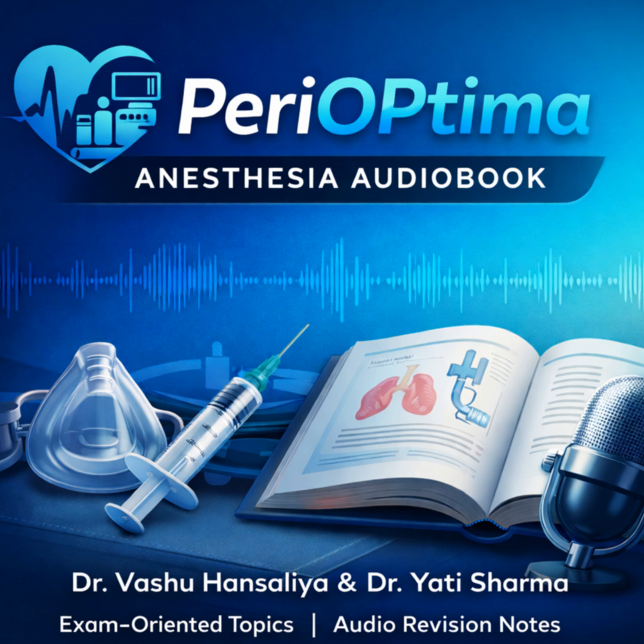So what is it? ECMO is a modified form of cardiopulmonary bypass, or CPB, but it's used for prolonged support. We're talking days to weeks in the ICU. What is the fundamental difference between ECMO and the CPB machine used in the cardiac theater? This seems essential for the anesthetist to understand. It comes down to two main things: time and reservoir. CPB is designed for hours, for the duration of surgery. ECMO is designed for weeks.